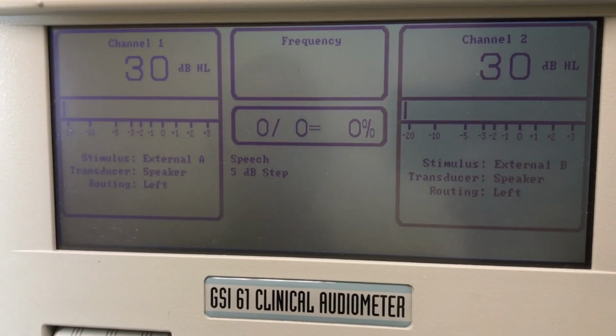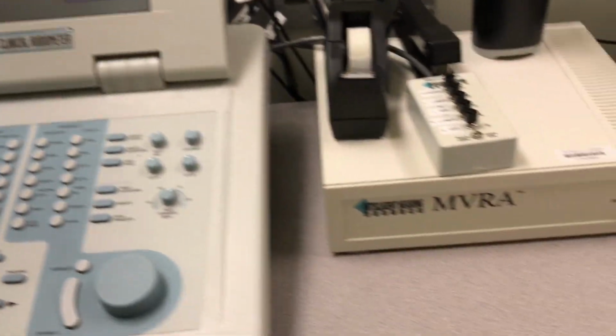The next thing we'll need to do is place the CD in the CD player and calibrate.